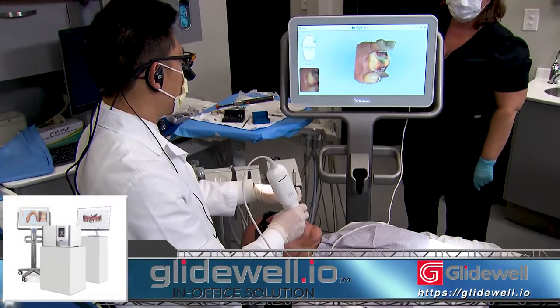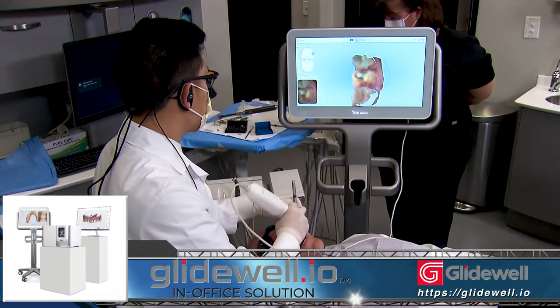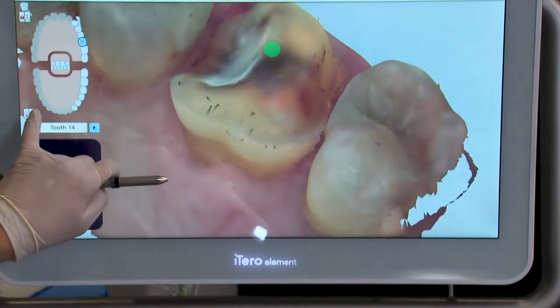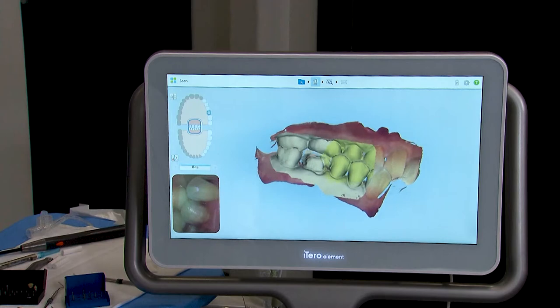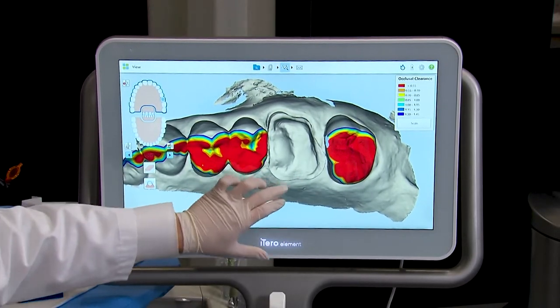Once I verify that I've achieved the appropriate amount of retraction, I dry the area well, then begin the digital impression using the iTero Element. Once the digital impression is captured of the prep, opposing, and bite, the data is transferred to the lab of my choice. In this case, it's sent to my Glidewell in-office design station.